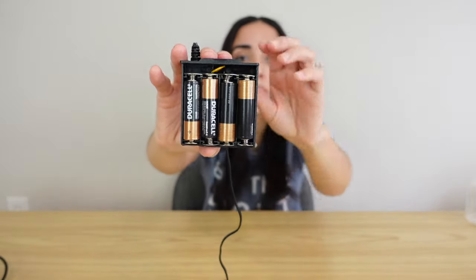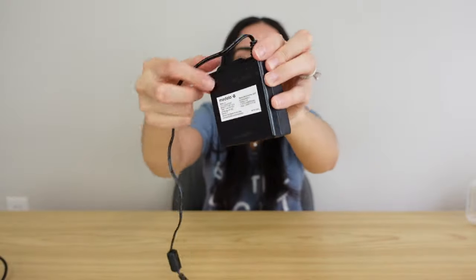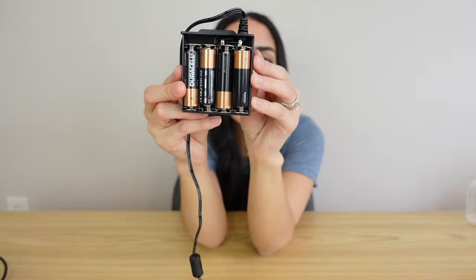One thing to know about the battery pack plug-in is that you will need to put in eight AA batteries. These AA batteries aren't included, but you can always buy a pack and leave it in your bag if you're going to be using the battery pack.